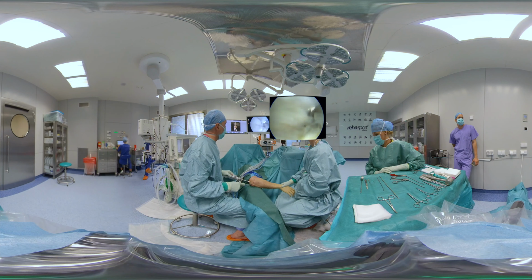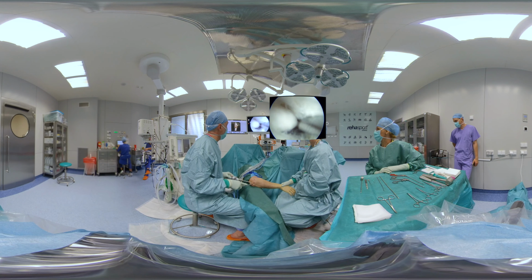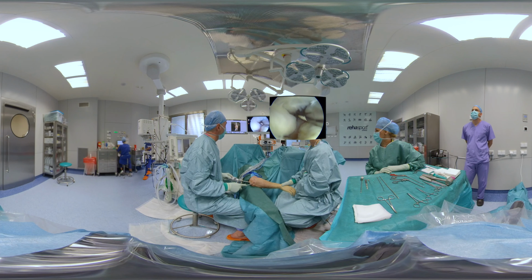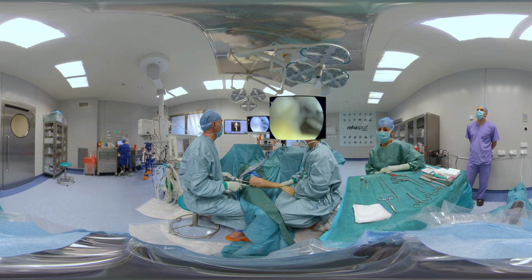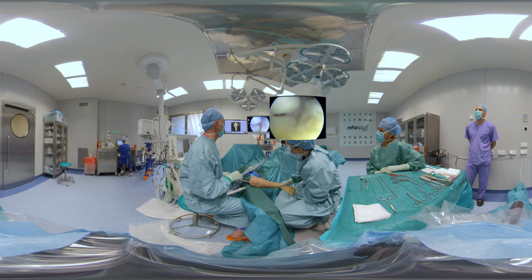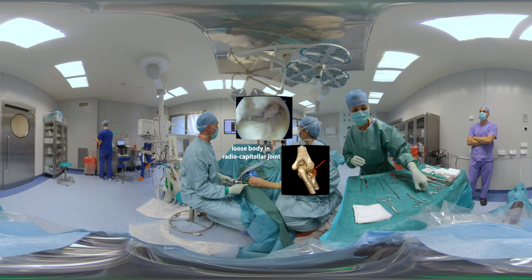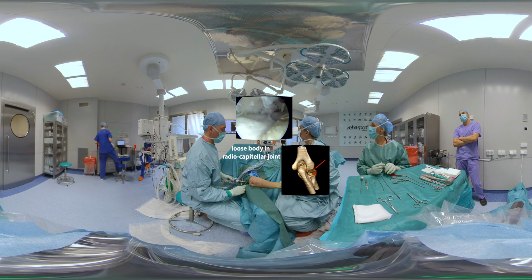With the soft tissue shaver, posterior aspect of radiocapitellar and radioulnar joints are exposed. Often, degenerate and inflamed posterolateral plica needs to be resected. Finally, semi-loose bodies found in radiocapitellar joints are resected in pieces.